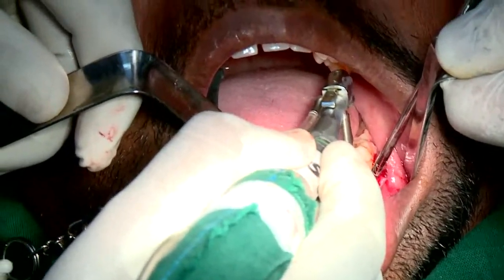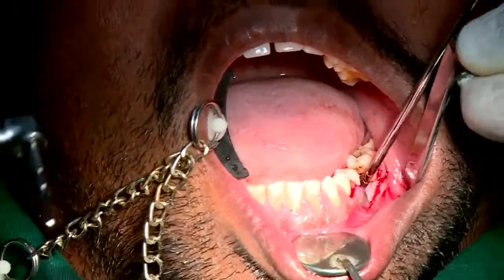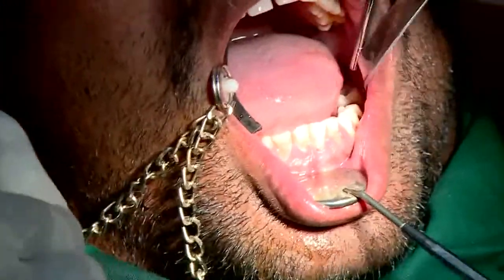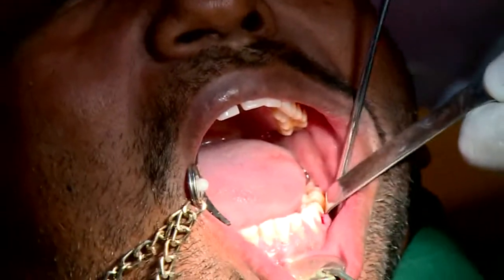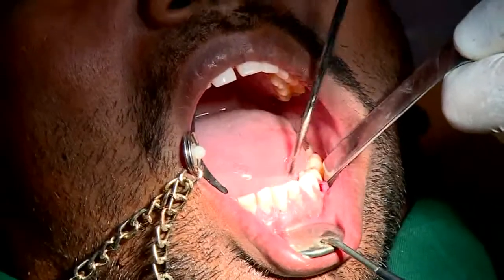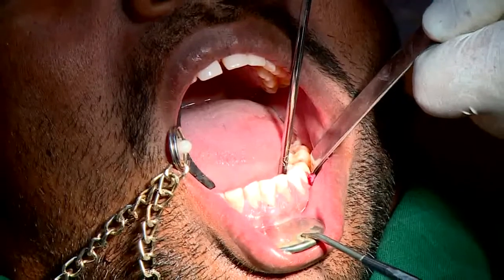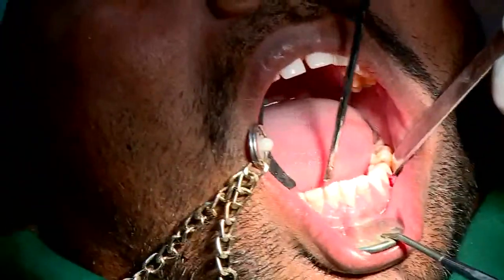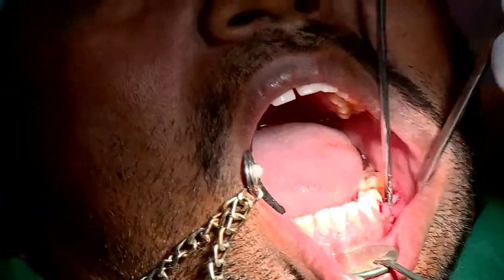At this point, I have one doubt, sir. Yes, please. 3.75 in the molar region, it's not ideal. Yes. We would actually like to go for 4.2 and above at least. Yes, the minimum 4. So what would you like to say about this one? In fact, that is what I requested for. But the bottom line is because of the very narrow crestal bone.